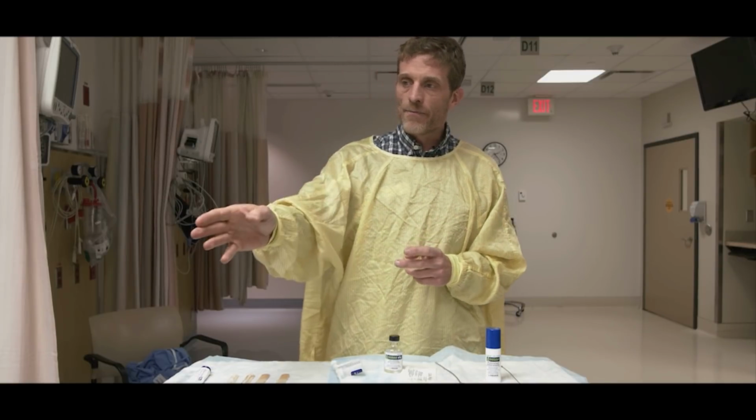A couple other points. You saw we were in a chair. I think that's the ideal position for a patient, unless you've got a stretcher that you can step inside the frame and get beside the patient. But these stretchers here have lots of stuff below the actual mattress, and you can't physically stand inside the frame, so it makes it quite awkward. You're either standing on the frame of the stretcher from above, or having to lean over quite a bit from the side.